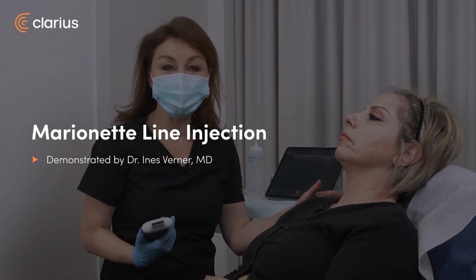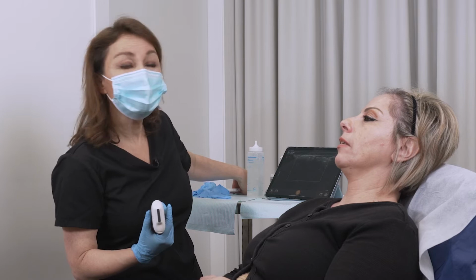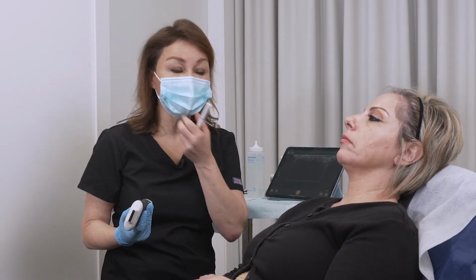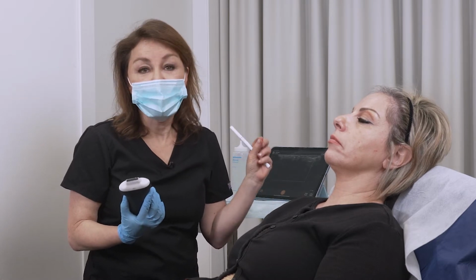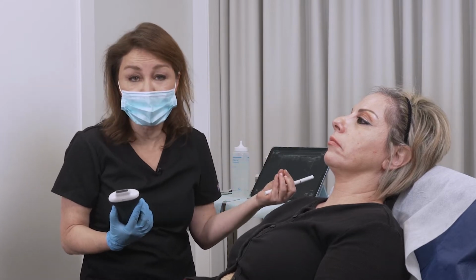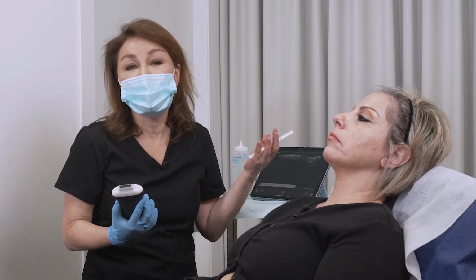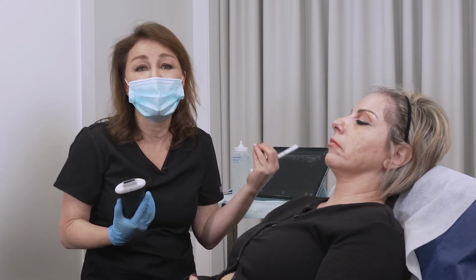We'll start with treating this patient, and first of all we will evaluate her, and she actually needs some filler injection, some filler treatment in her marionette lines, so in this area. When we treat the marionette lines, it's very, very important for us to map the inferior labial artery, because if we hit this artery or if we inject there intravascularly, we can actually get skin necrosis in that area. So this is our main risk, and this is something that really can happen.